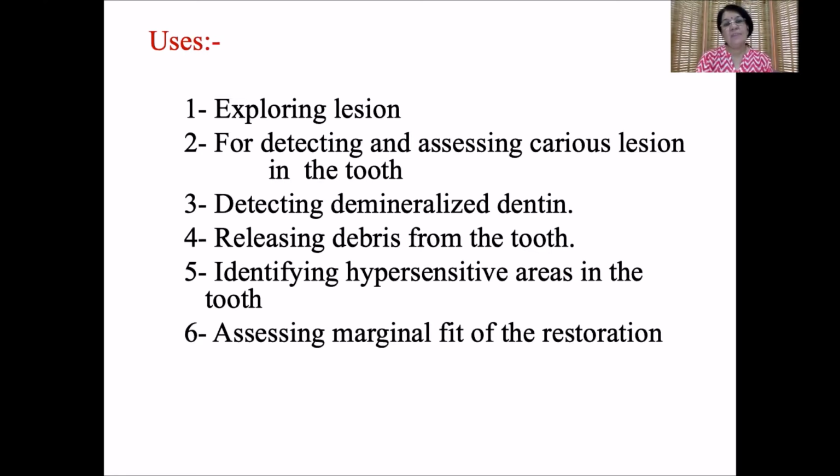So if you have an instrument and you move along the area the patient is pointing out, maybe you will be able to identify the area where there is pain, because that tip of the probe will definitely irritate the area and the patient will feel pain, and you will know that this is the particular area where the patient is having pain.